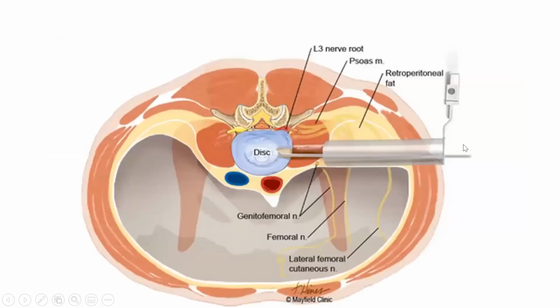The DLIF's got a couple of advantages. So you can put it in percutaneously. You can put in a little wire and just check with electrical current whether you get into the plexus or not. If you're happy, you can dilate it up, and you can basically do percutaneous DLIF, directly lateral, avoiding the stomach contents and peritoneum. You can go directly lateral, and you can do discectomy.